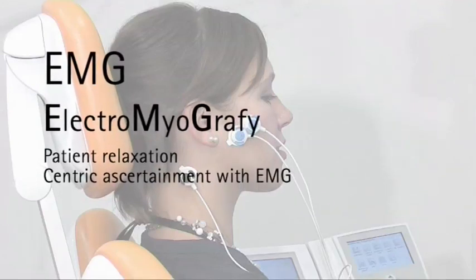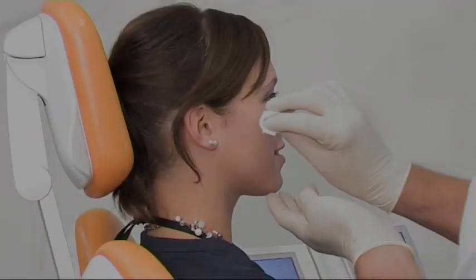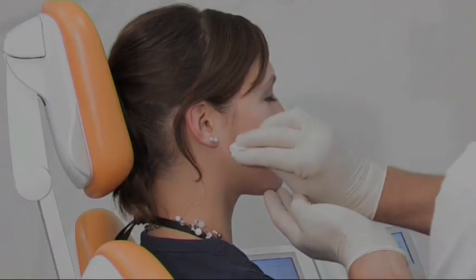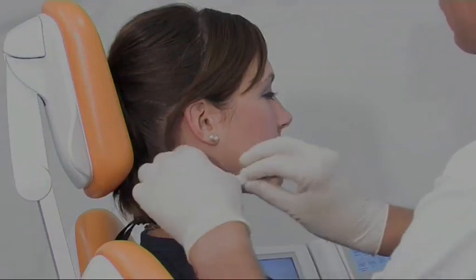Muscle tenseness by the patient can prevent, or at least strongly restrict, a successful continuing treatment. The display of the action potential of the muscular system provides a valuable aid here. EMG, electromyography. Patient relaxation, centric ascertainment with EMG.